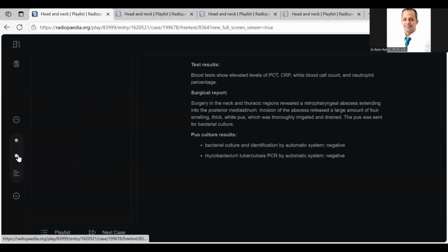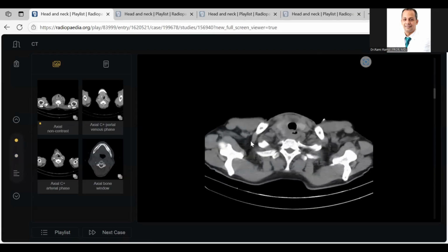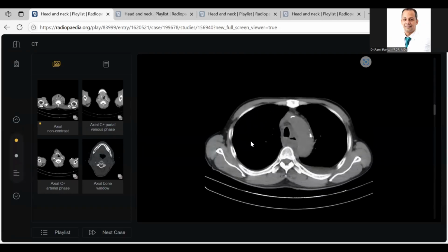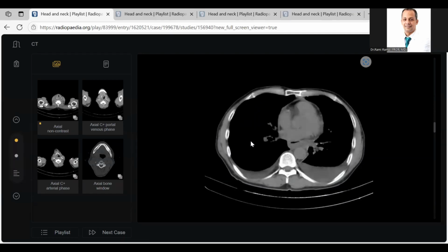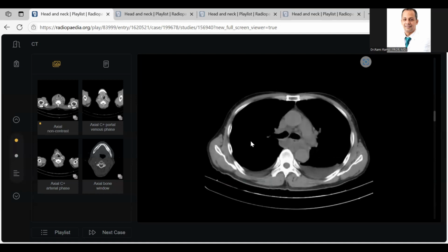I think there is no MRI. This is a classic case. You may be given a case like this in the exam, despite it being very clear and classic. Why? The examiner wants to assess whether you are safe or not. Take care, my colleagues. It's better to tell the examiner it is retropharyngeal abscess associated with mediastinitis, life-saving, needs drainage. All the examiners need buzzwords.